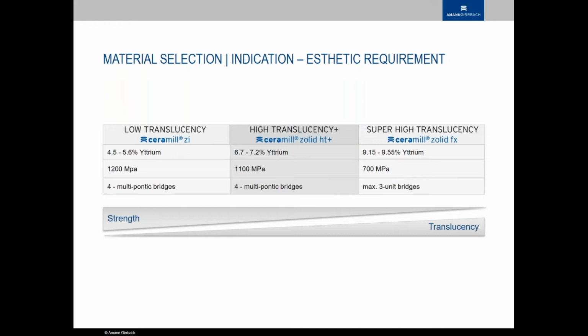If you're looking at the pictures on our website and you're thinking, man, I cannot get it to look like that, I can guarantee you it is possible. I make many samples here that look like they do on our website, but you have to follow the steps and keep the LT separate. If you're in the lab mixing different materials, then try to sinter each new material by itself as a test, maybe on new beads. Then you know what the material is capable of and what it's supposed to look like, and then you can try to mix and match, and you would immediately know when something goes wrong.